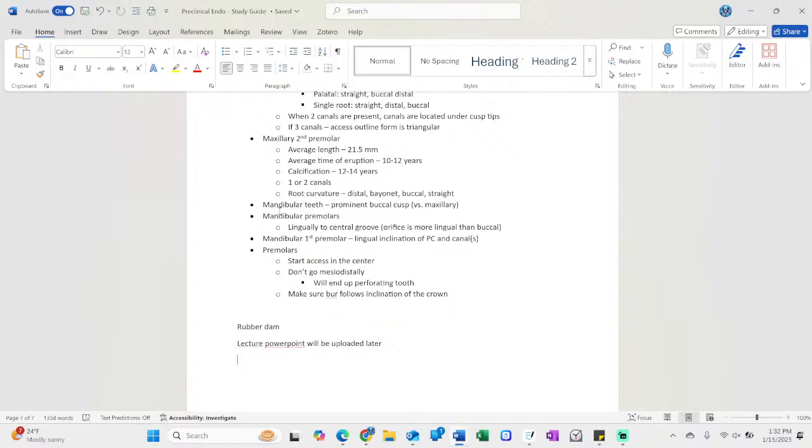So obviously you've got the wing clamp and the wingless clamp, depending on the space that you have available. I like to use the wing clamp most of the time. I just find that it's a little bit sturdier.